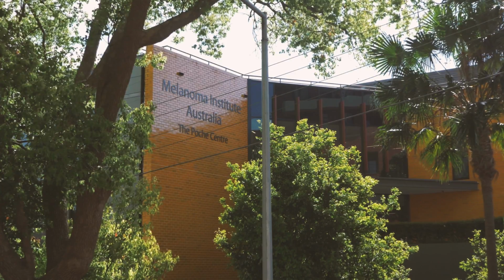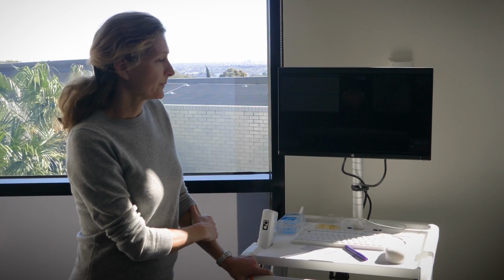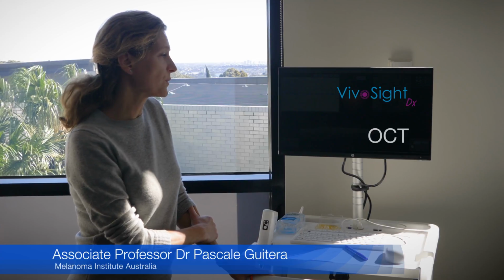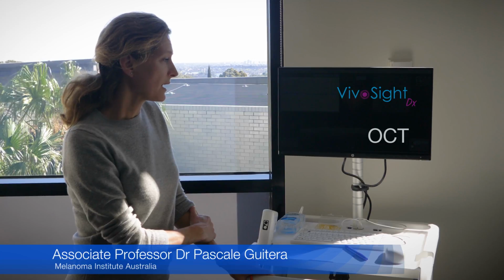And in terms of if you were describing it to a dermatologist who wanted to use it in their practice, what would you say that you'd actually use this for? So clearly I tell them that it's great because we can go deeper, it's very quick to do a scan, but we don't have the cellular resolution.